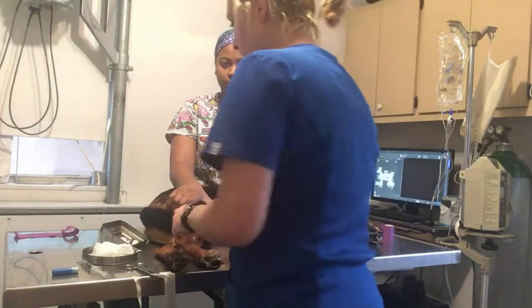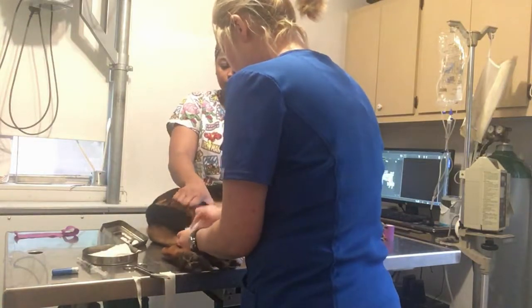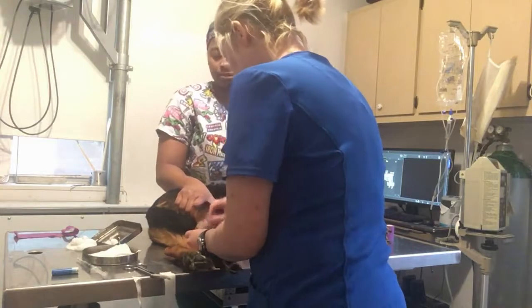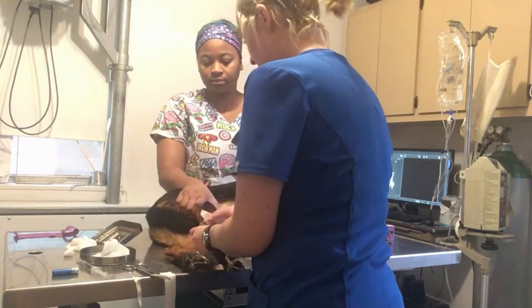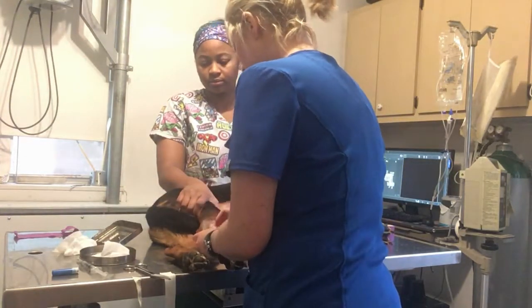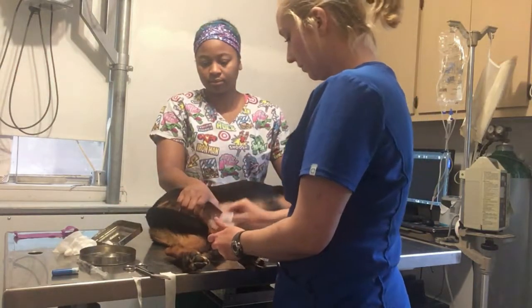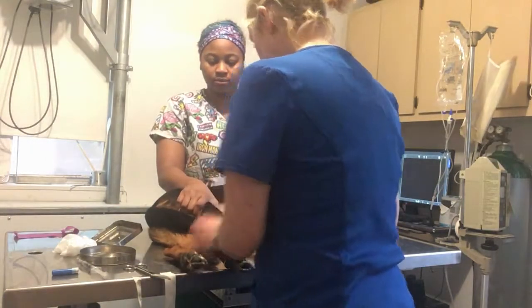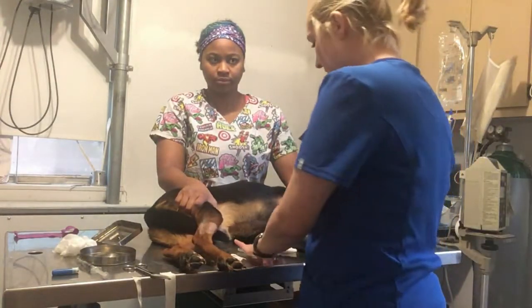Alright. Now that I have that shaved, I'm going to go ahead and scrub the area. Good boy, Rudy. Now that the area is scrubbed, I'm going to go ahead and take my catheter.